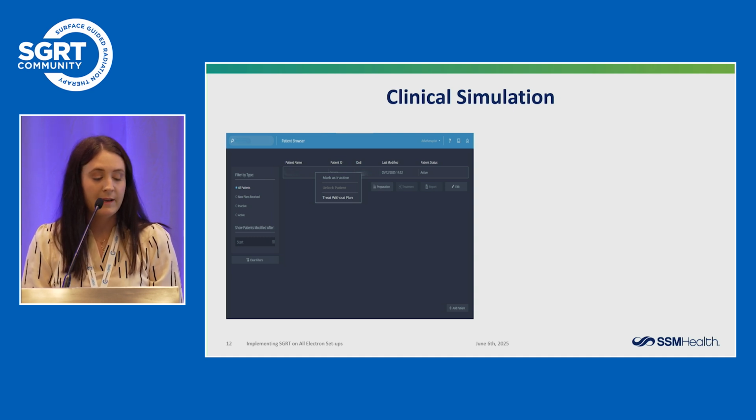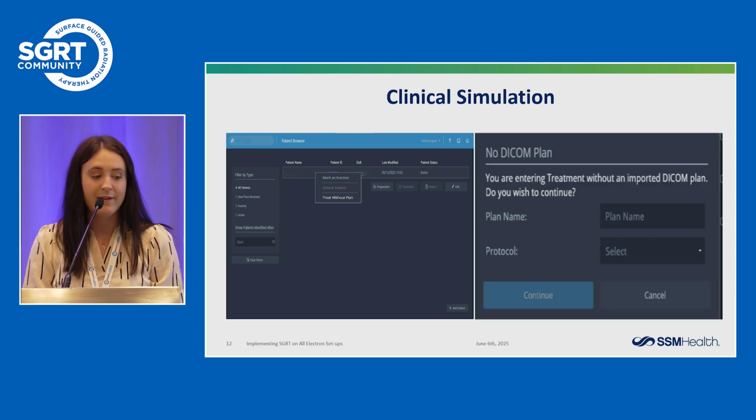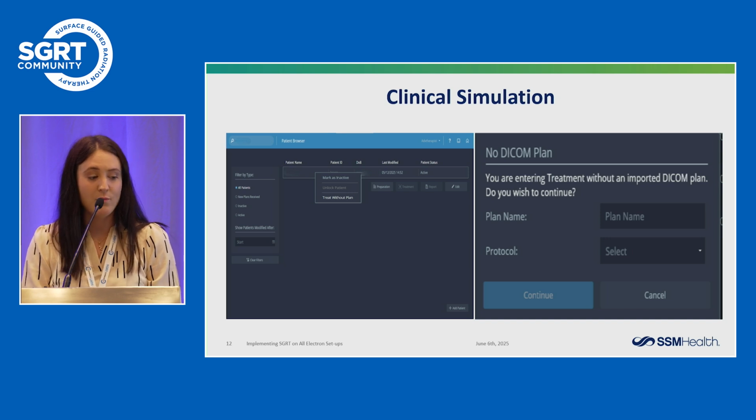Once we hit Treat Without Plan, it's going to pull up this box here saying, are you sure you want to do this? You don't have an imported DICOM plan. Yes, we want to proceed. We're going to create our own plan.